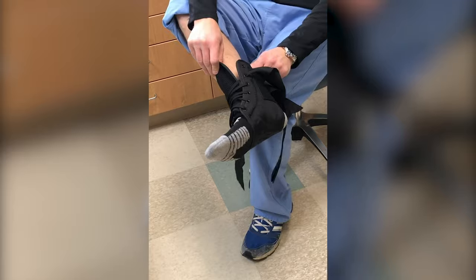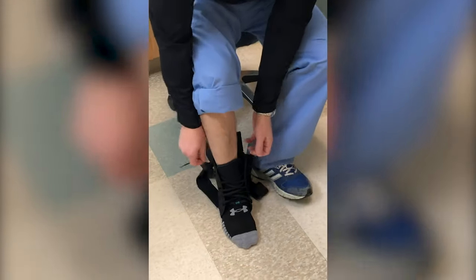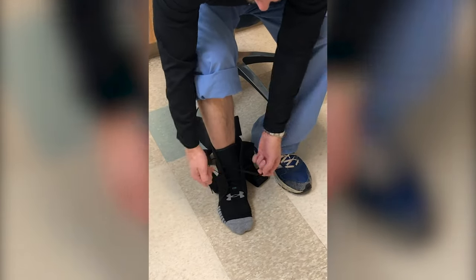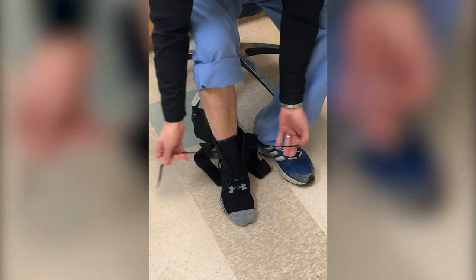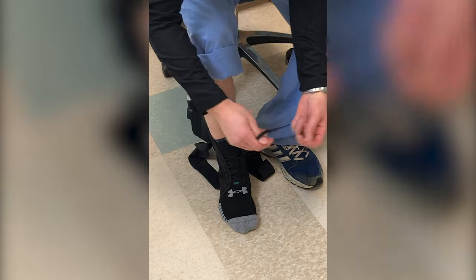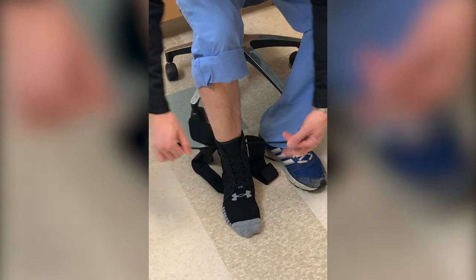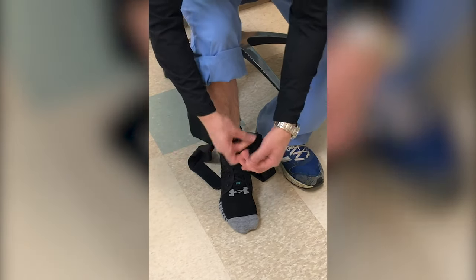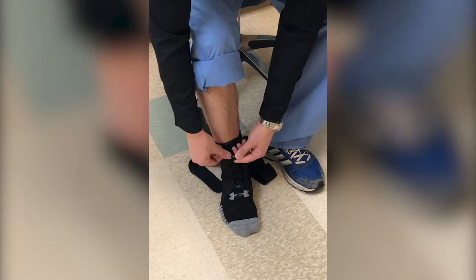Make sure your heel is seated down nice. Go ahead and tighten up the laces — nice and snug. Then thread the last holes and tie it like you tie your shoe.